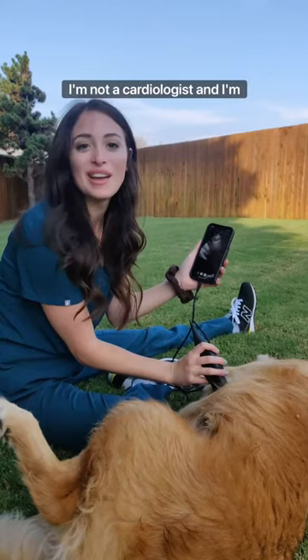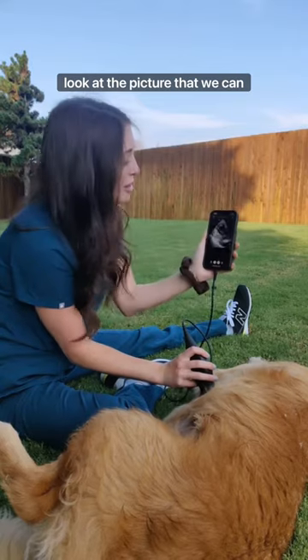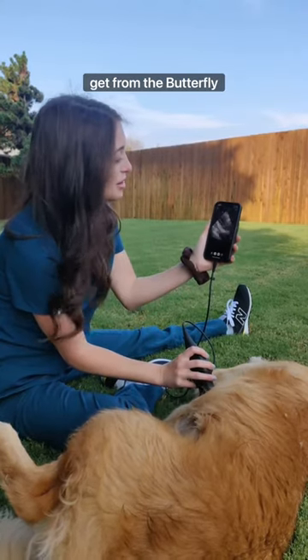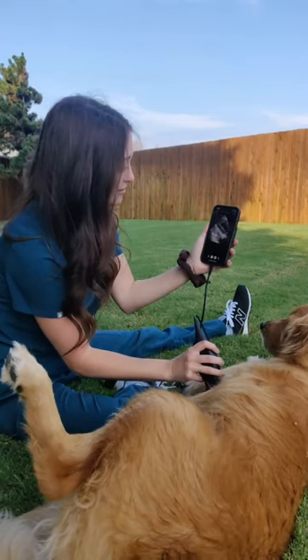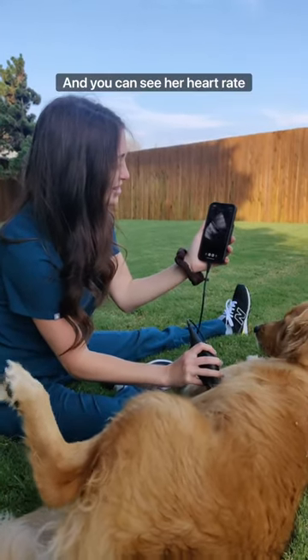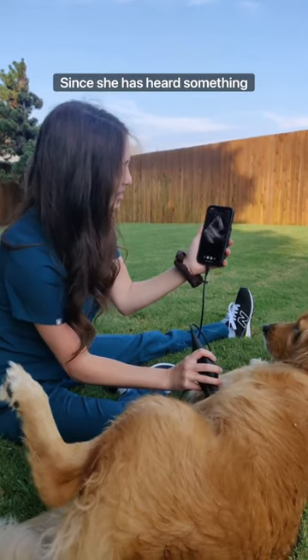Admittedly, I am not a cardiologist and I'm not the best at looking at dog hearts, but I thought you'd still want to see the picture that we can get from the Butterfly IQ Ultrasound. And you can see her heart rate has increased since she has heard something across the fence.